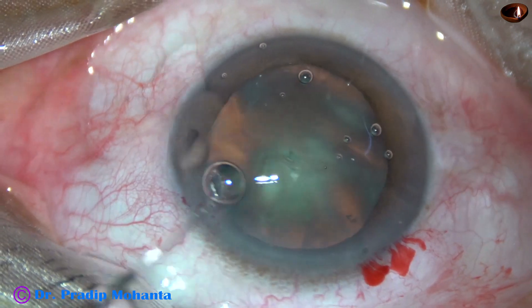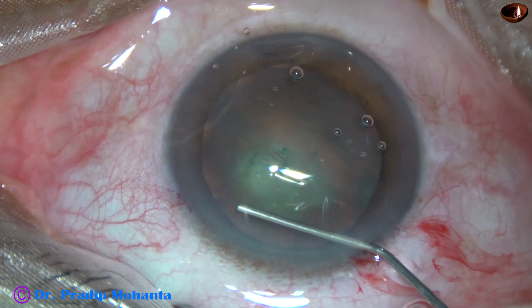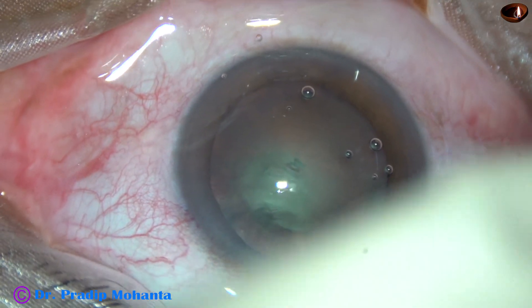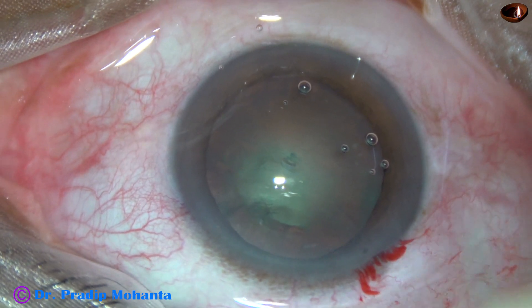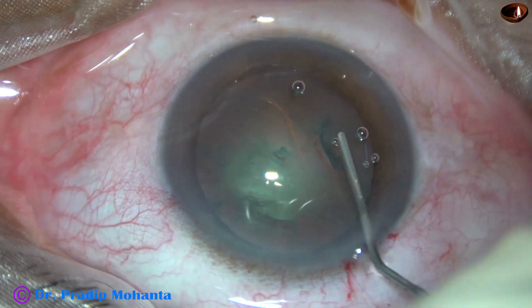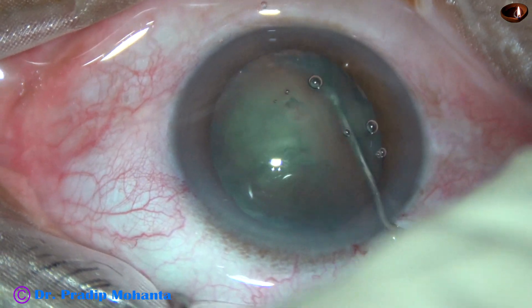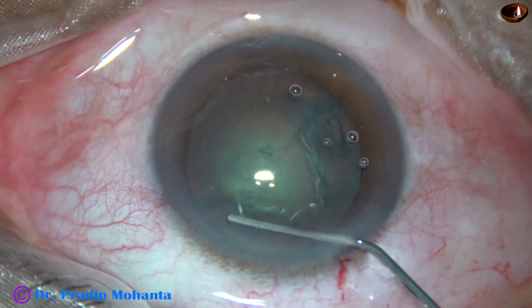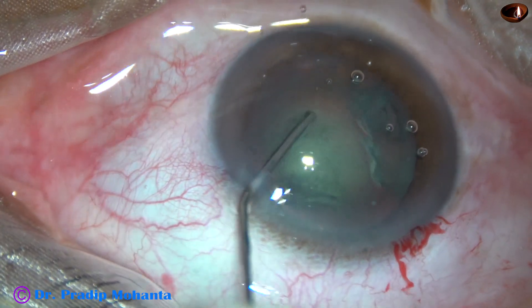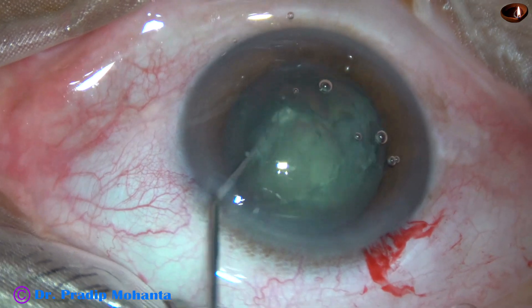And now hydrodissection. A 27-gauge cannula and BSS is used for hydrodissection. Hydrodissection is done, and the nucleus rotates.